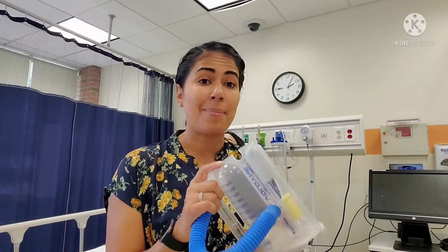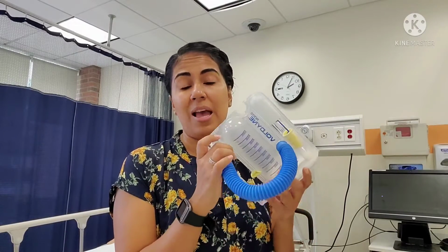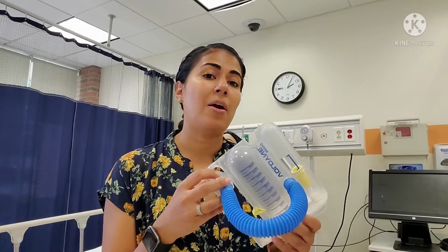So we want to get them up in the chair, use the incentive spirometer. Some of my patients absolutely cannot do this at all, and they become frustrated and anxious about it, and that's the opposite of what we want. We want to encourage. So what I often will do is speak to the provider, and we'll talk about taking nice big deep breaths in and holding it, and I do it with them every time I walk in the room. Okay, take a nice big deep breath in with me, let's hold it, and let's out. And oftentimes that's going to be a lot more positive for them. If they're struggling with this, we still want them to be doing their breathing exercises.